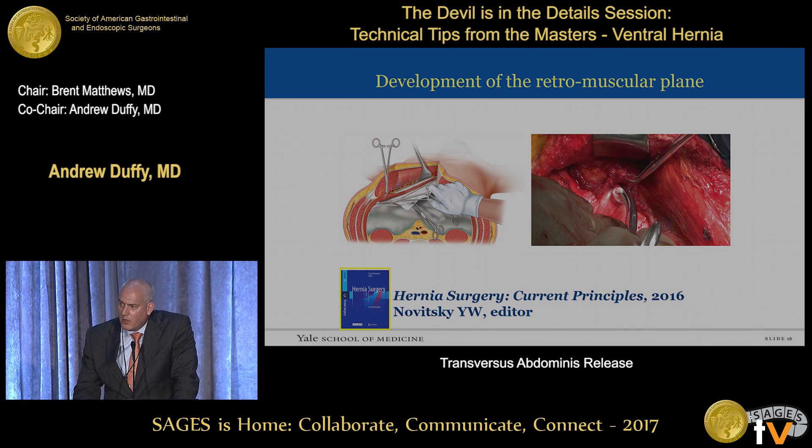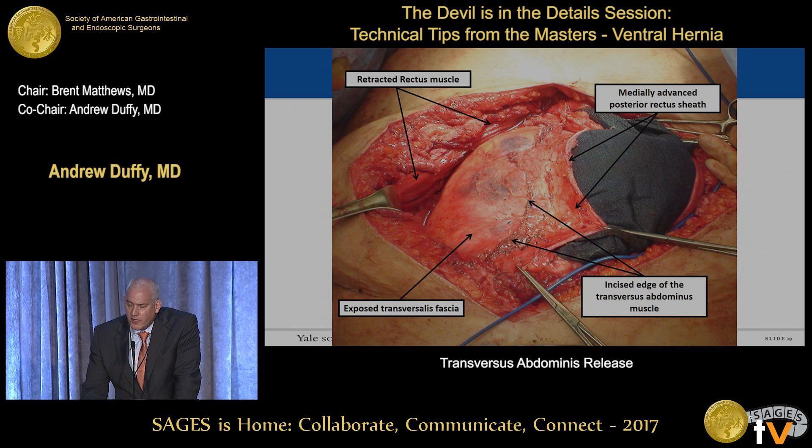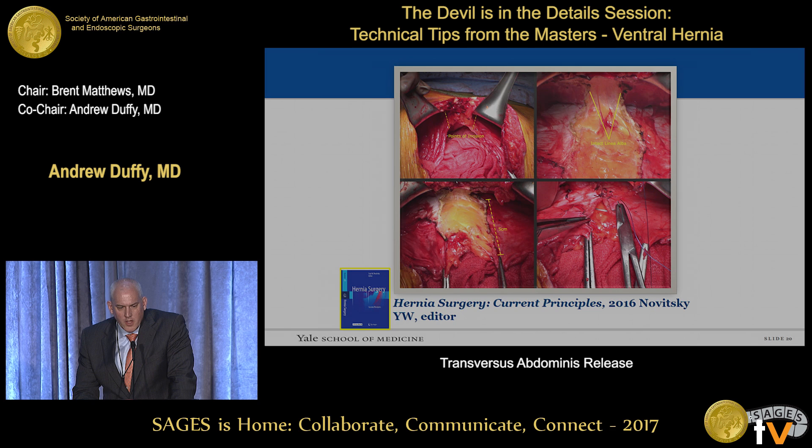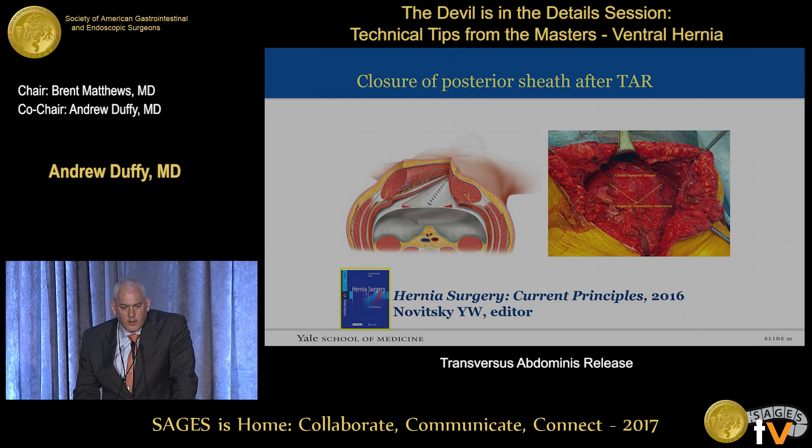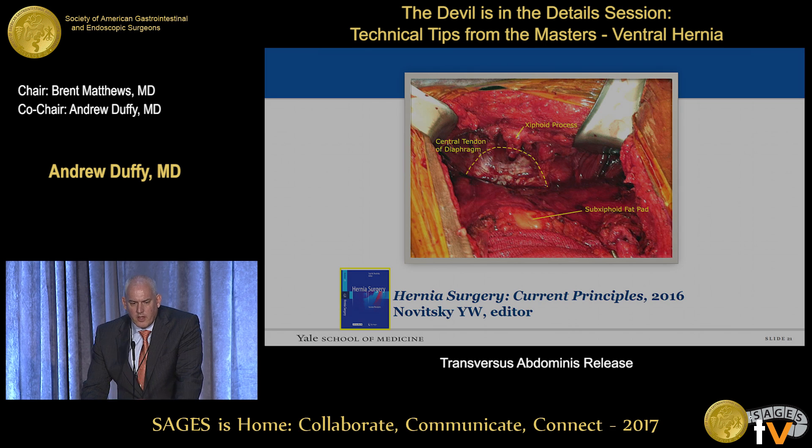You can develop this retromuscular plane, preferably staying anterior to the transverse abdominus, although sometimes this is truly a preperitoneal plane. You can get a significant release — about double what you get from the retrorectus release alone — with the rectus muscle retracted to the side showing significant medial advancement with the exposed transversalis fascia and the incised edge of the transverse abdominus muscle. Superiorly, where the linea alba splits around the sub-xiphoid fat pad, you can carry this all the way up towards the central tendon of the diaphragm, giving excellent exposure. The xiphoid, by the way, makes an excellent anchoring point for the mesh.